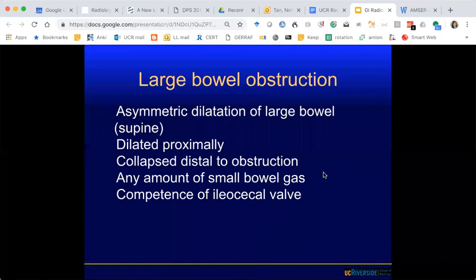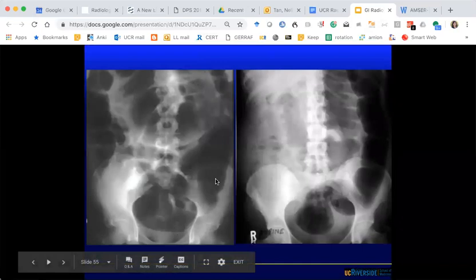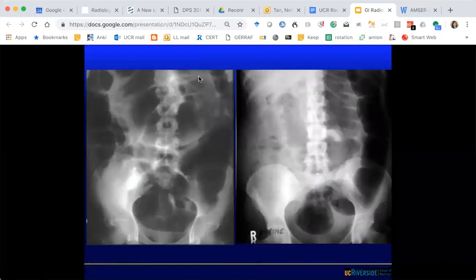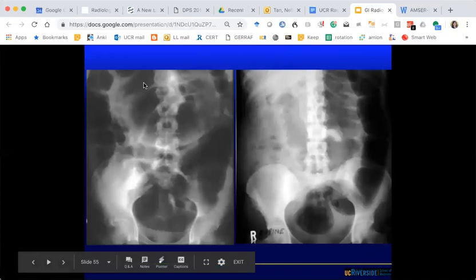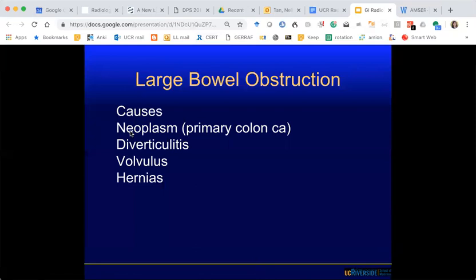Large bowel obstruction, in contrast, shows picture-framing — diffusely distended large bowel along the transverse colon, descending colon, and cecum. Where would you put the obstruction? Distal — because you see the entire length of the colon distended. What is the most common cause of large bowel obstruction by far? Colon cancer. If you see LBO, be highly concerned about colorectal cancer. Other causes include diverticulitis causing inflammatory obstruction, but colon cancer is by far the most common.